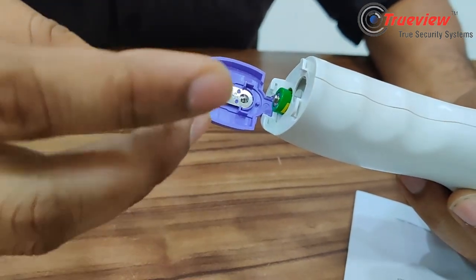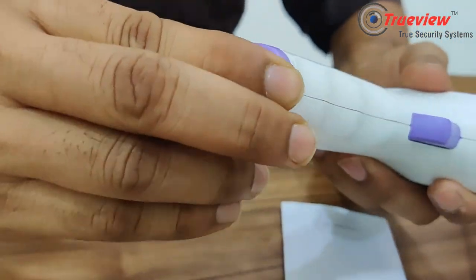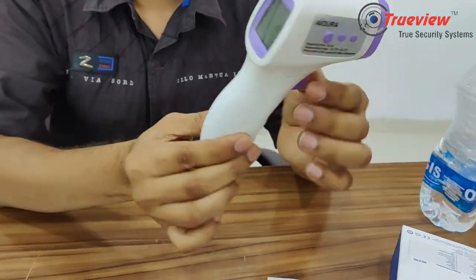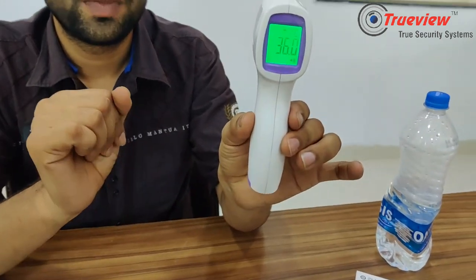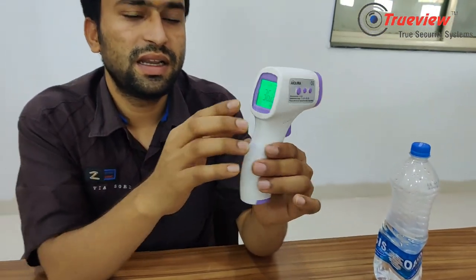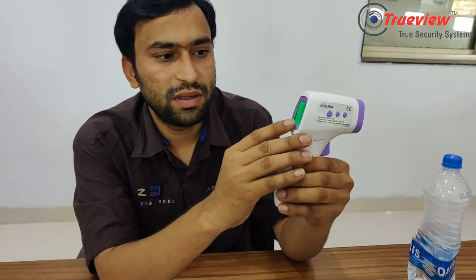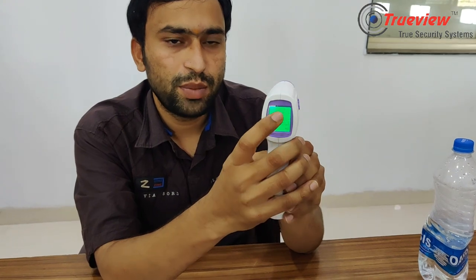Then you have to press the button. After pressing, the screen will start up. Now you can see here is the person symbol and degree Celsius, showing how many degrees Celsius has been measured.